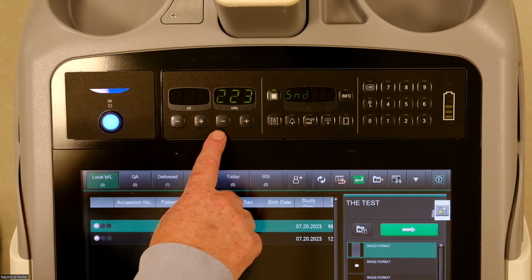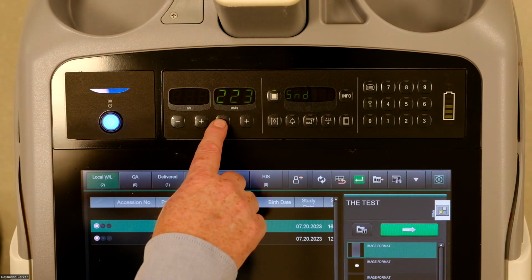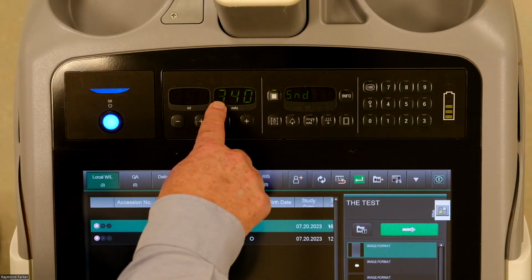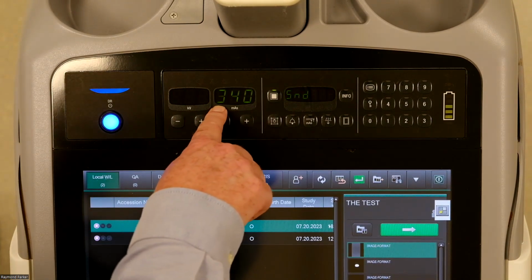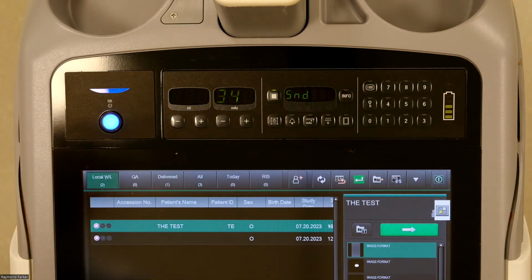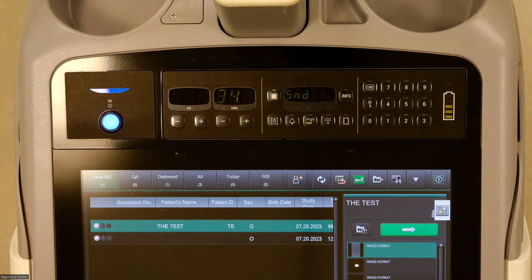Which one I want to bring to your attention is the third one. So if you tap the minus button again, you'll see the first digit in this mass field will change to a 3. That's for your movement sounds. Generally, your customers will prefer to have no movement sounds.